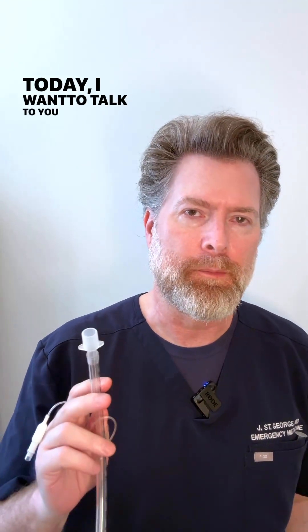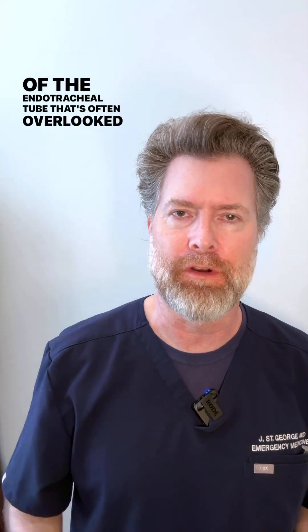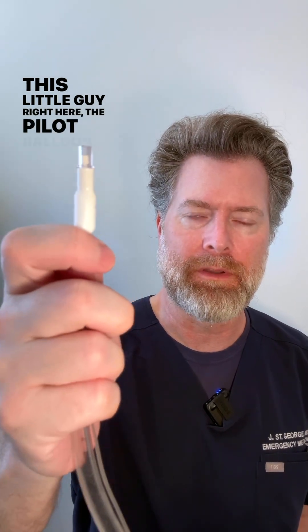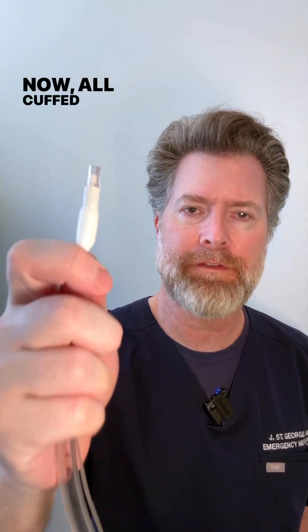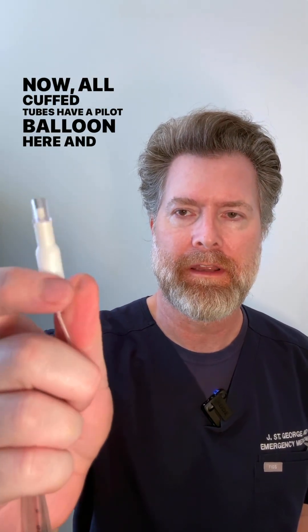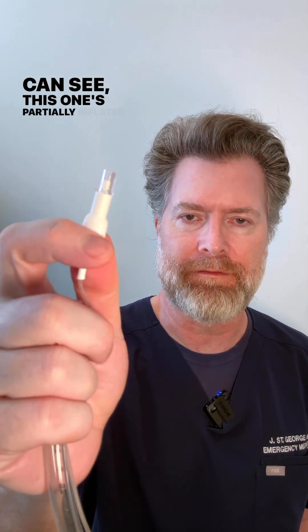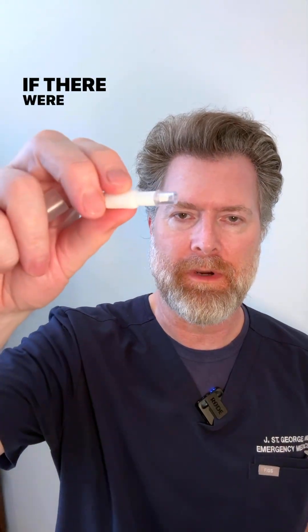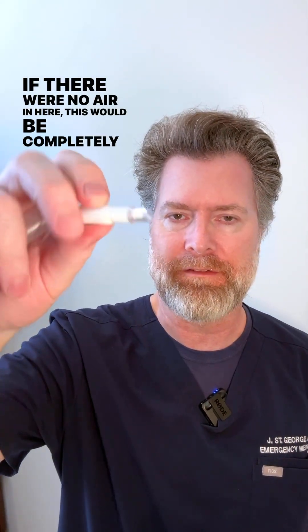Today I want to talk briefly about one critical part of the endotracheal tube that's often overlooked — the pilot balloon. All cuffed tubes have a pilot balloon, and as you can see this one's partly inflated. When you press it, you can feel that there's air inside the cuff down here. If there were no air in here, this would be completely flat.